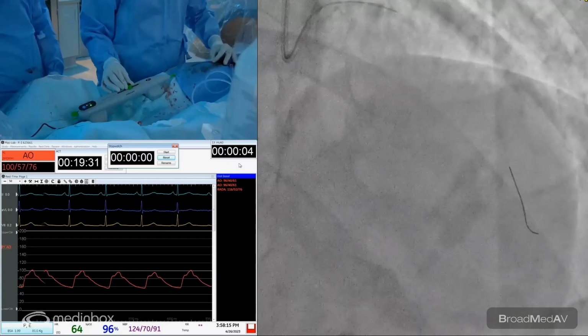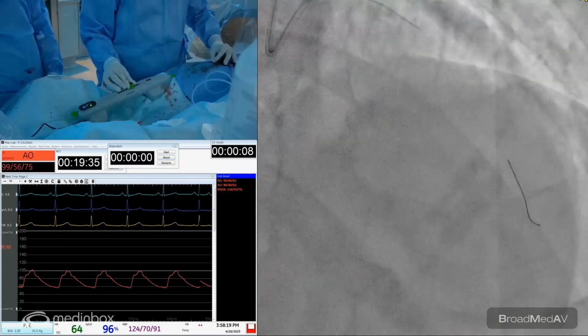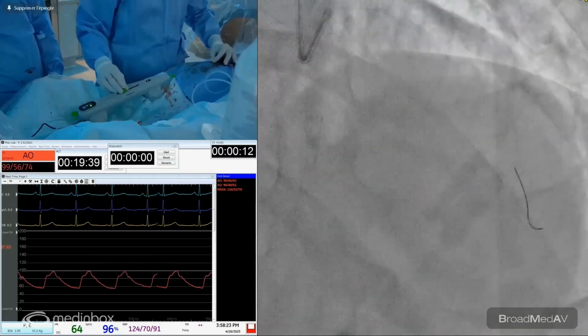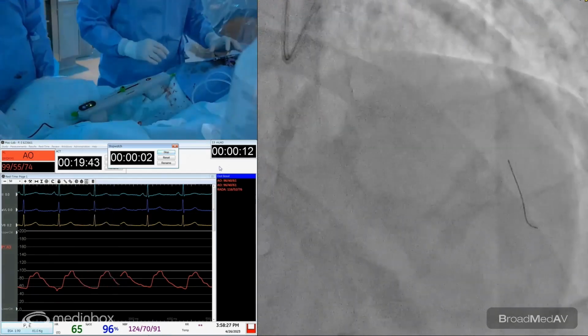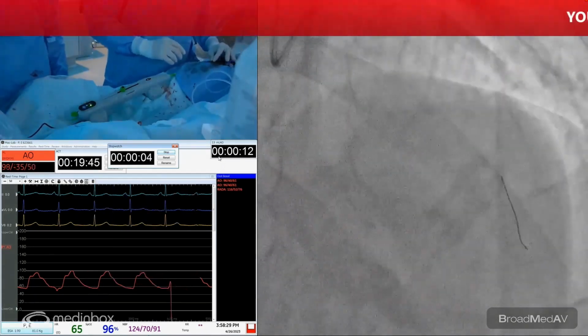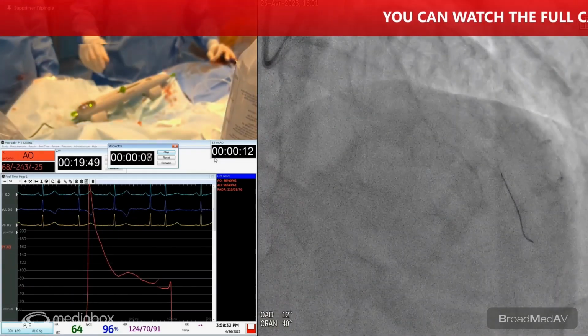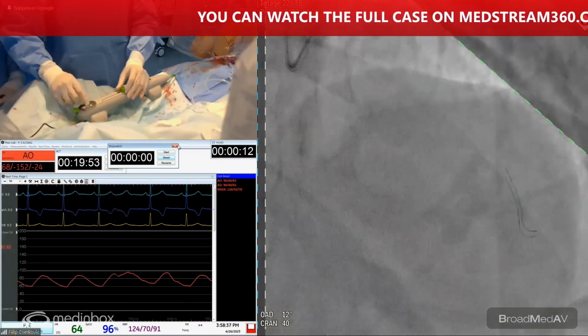I want to stay away from that second curve because I don't want to go there. Because as you can see, there's a bend while contraction. I do not want to have any stent fracture. So I think this should do the job. We'll do a small test, make sure that things are good. Things look pretty good. And out we go. So to go out, open the lever.